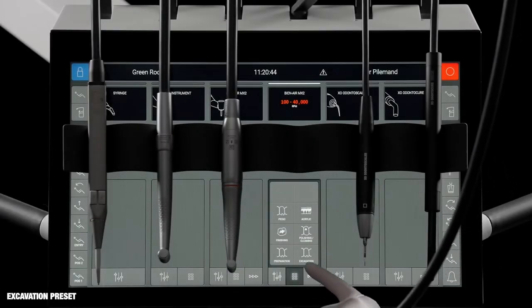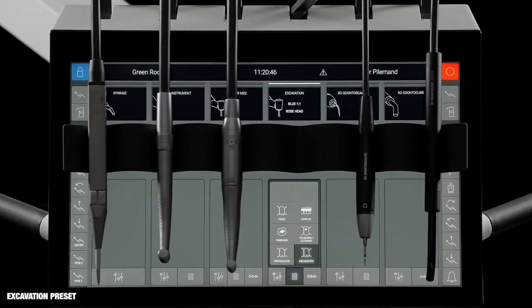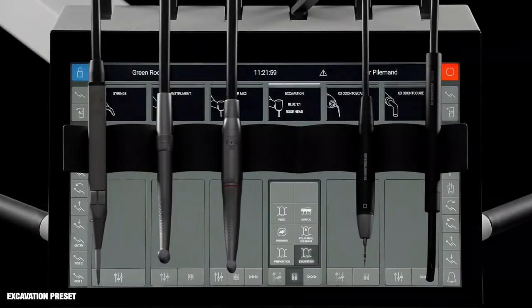When, for example, the excavation preset is activated, the micromotor is set up for excavating decayed dentine. The operators are instructed to fit a blue contra-angle with a rose burr on the micromotor. When the foot control is activated, the burr rotates with a constant low speed of 2000 RPM, optimal for removing decayed dentine.